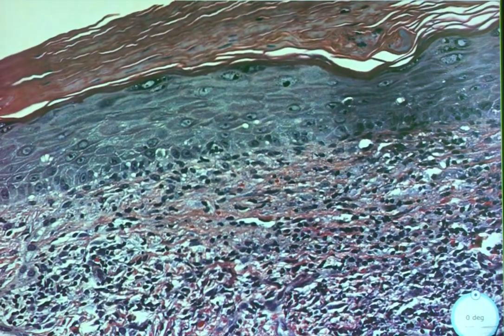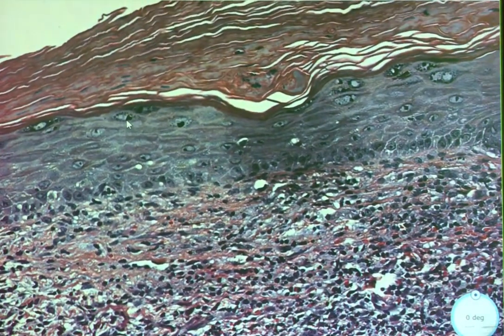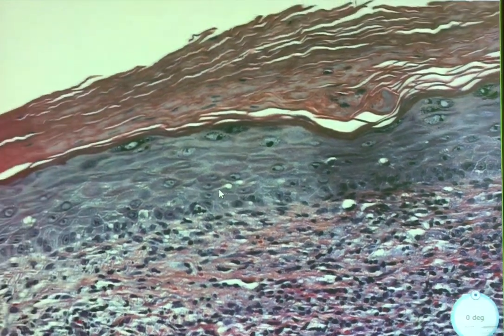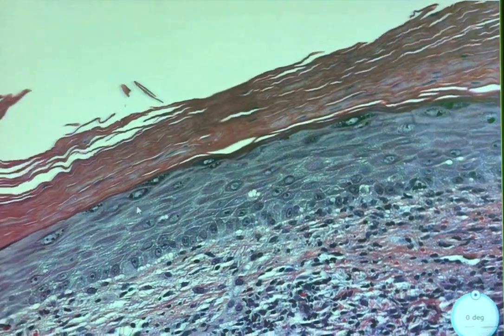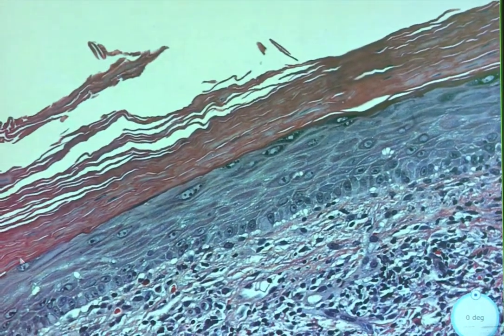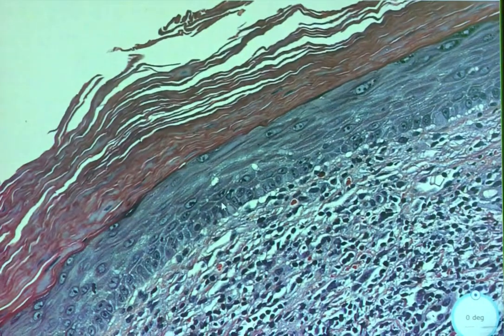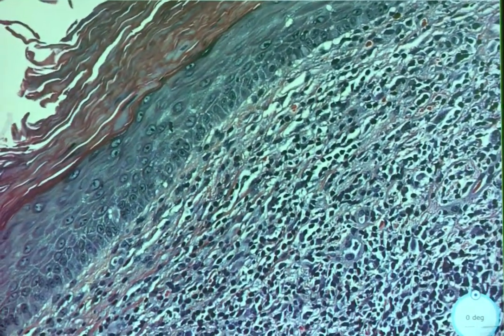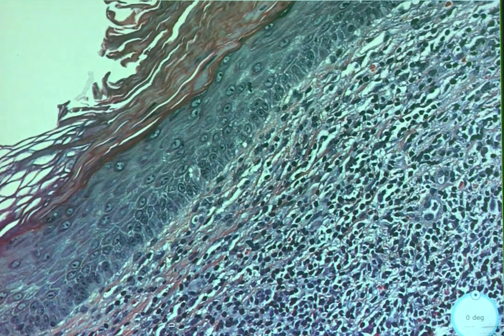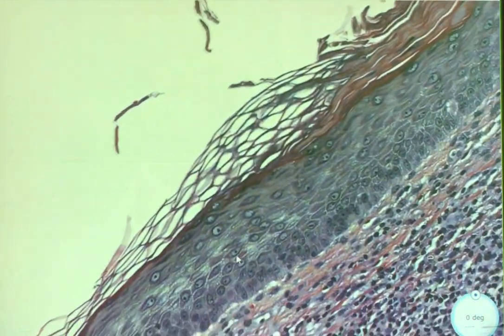So there is some parakeratosis here. Do you see these guys? All these nuclei? So that's parakeratosis, because normally we shouldn't have nuclei up in the superficial keratin, right? Yeah, makes sense. So you just knew what we hadn't seen already. I just knew about the lesion, how it would look.